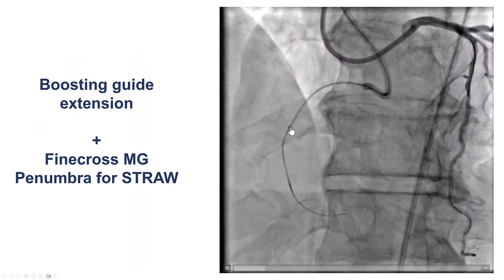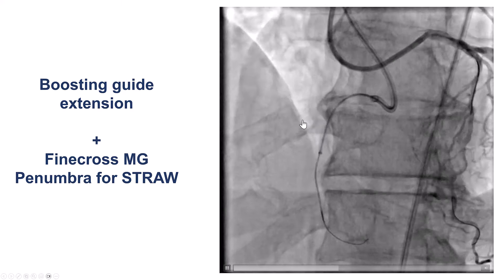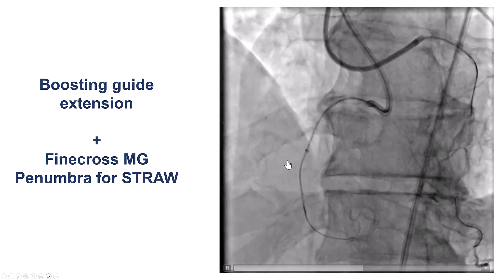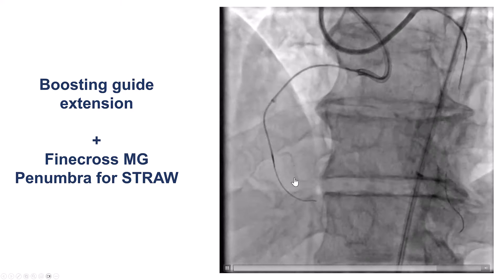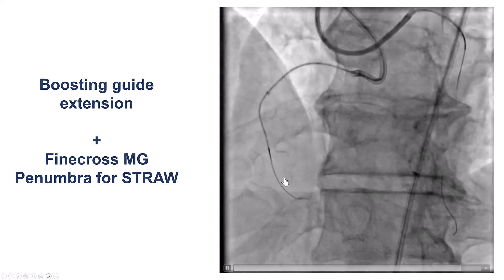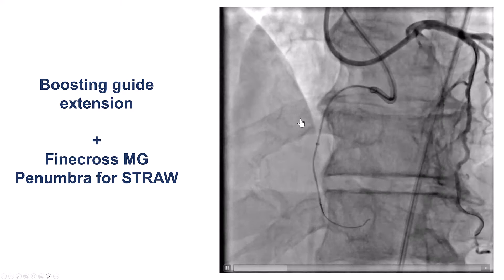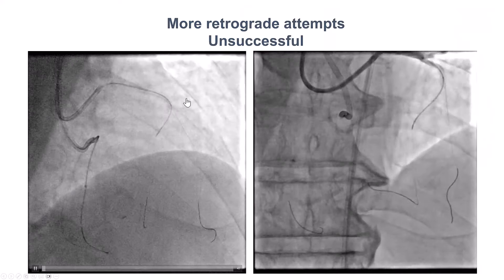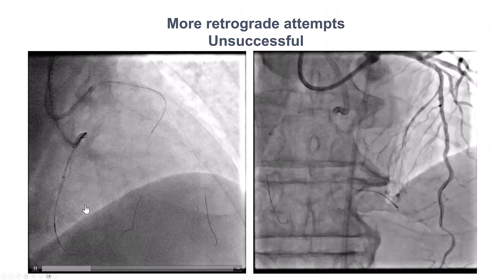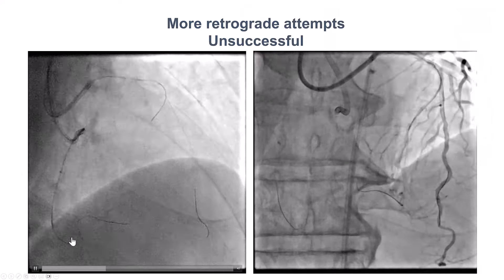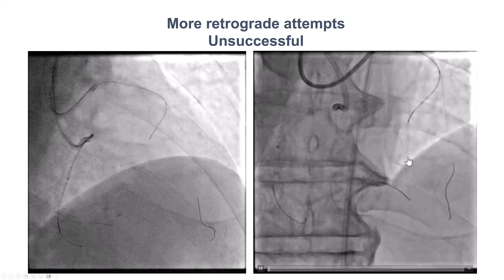He did have a lot of hematoma, so we decided to use a guide extension to try to prevent the expansion of the hematoma. We then did the straw technique both through a microcatheter and also using aspiration through the stingray balloon. Given the trouble we had antegrade with the hematoma, we tried retrograde again.